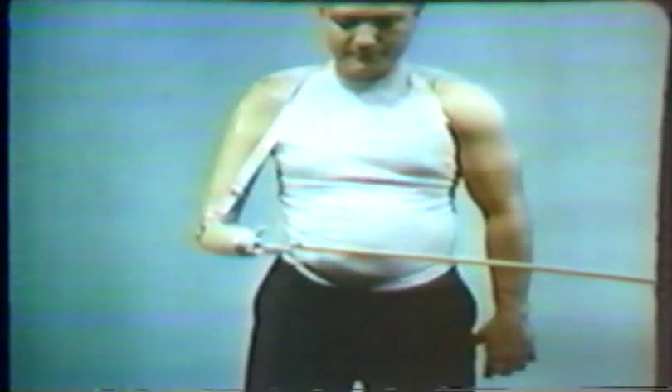Additional cable excursion and force for elbow flexion and terminal device operation is obtained by abducting the scapulae. The motion of scapular abduction provides excellent force but only moderate cable excursion. Here the amputee demonstrates how a combination of shoulder flexion and scapular abduction is used to flex the elbow and to control the terminal device.